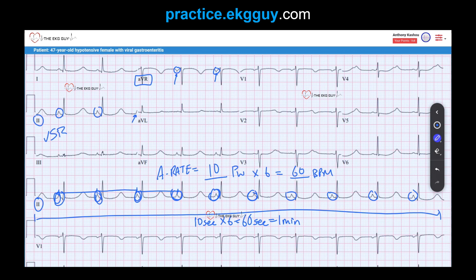You'll see sinus rhythm used alone, and when we say sinus rhythm alone, it actually infers a normal atrial rate. So sinus rhythm or normal sinus rhythm — they mean the same thing. They're inferring that it originates from the sinus node as well as having a normal rate. Otherwise, it would be classified as sinus bradycardia or sinus tachycardia.